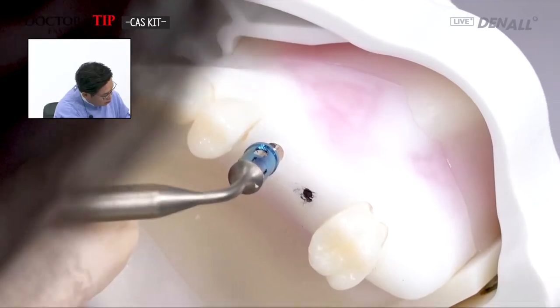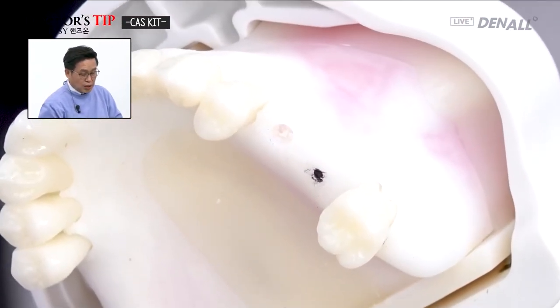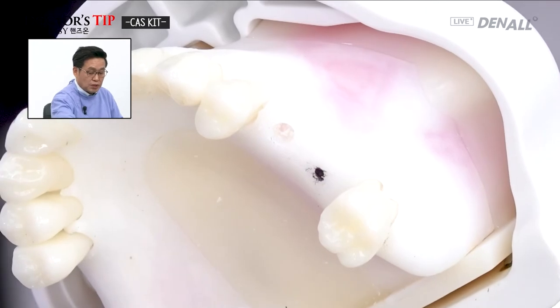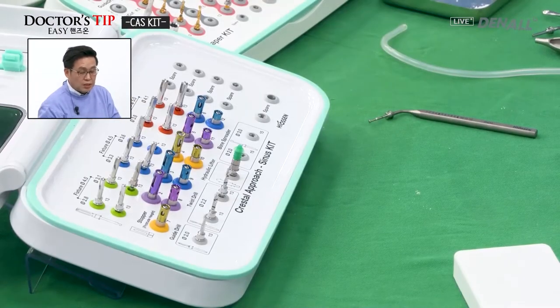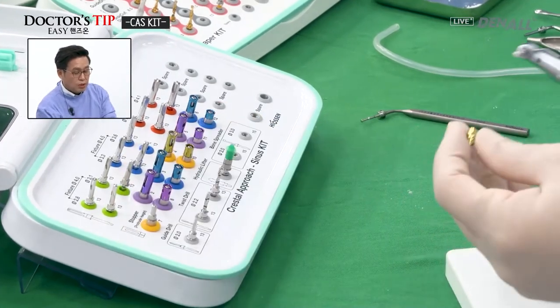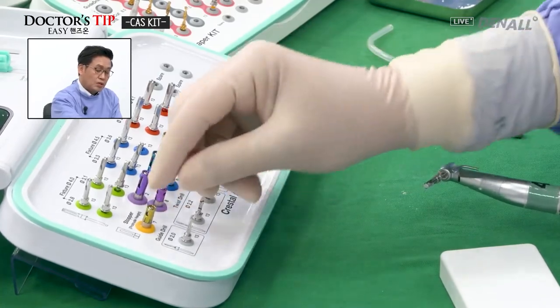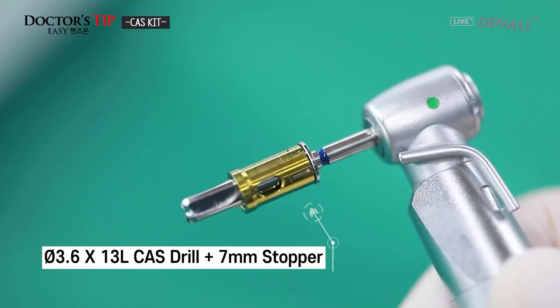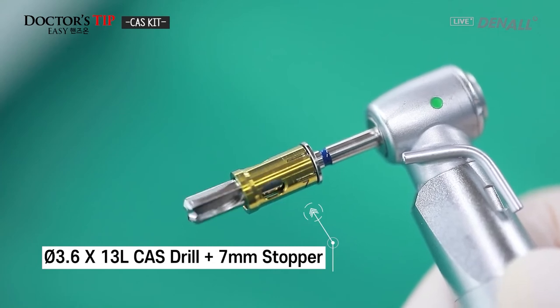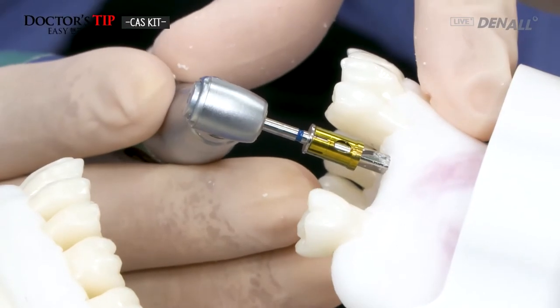The residual bone height is 5 millimeters, but there's a slope near the adjacent tooth. Therefore, we need to go a little bit deeper than we expected. The final drill is 3.6, so the drill diameter is not to be increased. A 7 millimeter stopper is used for the drilling. Seven millimeter stopper.